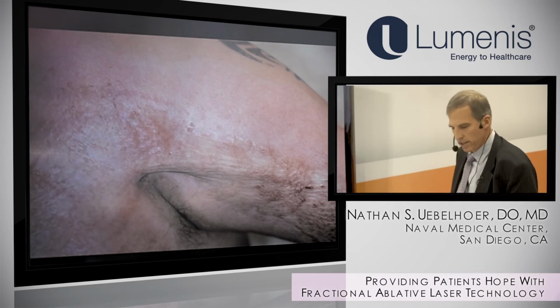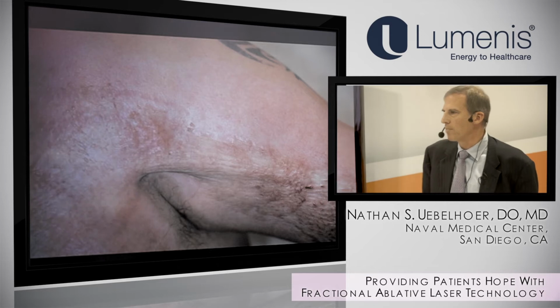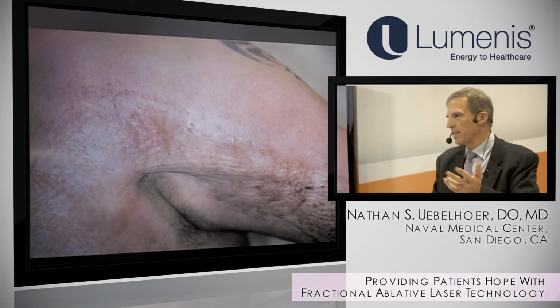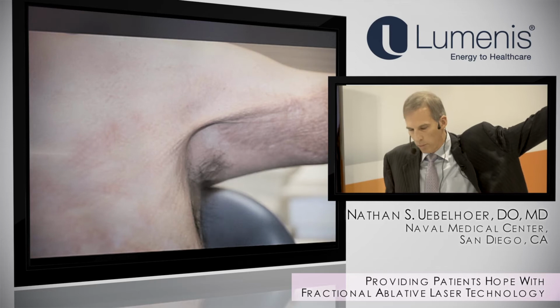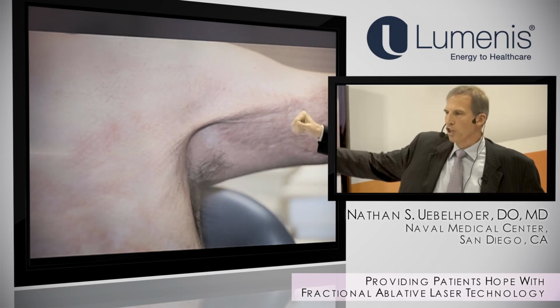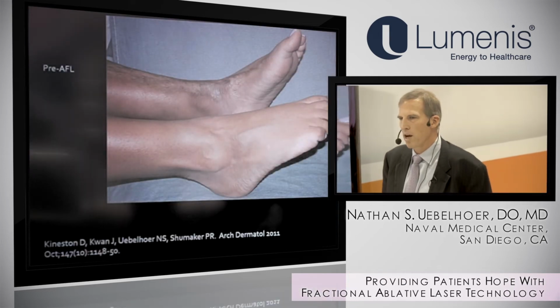Again, I don't know if you can see on the screen the blanching of the skin as he tries to raise his arm and can't do it. We treated him 1 time. He had improvement. We then treated him again 6 times or more, and he was able to raise his arm essentially normally. Which was fantastic. So not just fingers, not just the neck, but large limbs too. And not only scars, but also scarring processes.